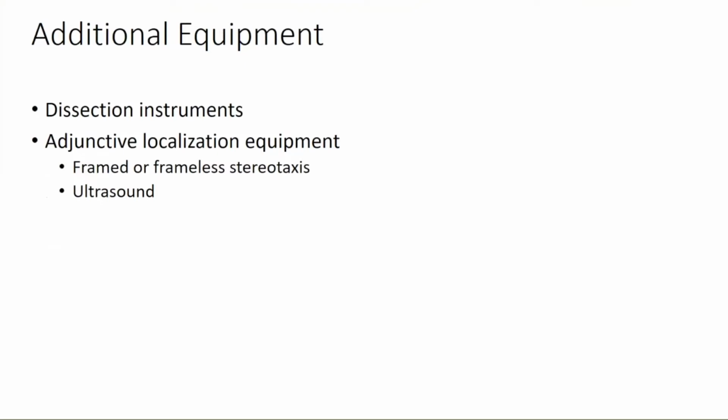We don't always need neuronavigation, but certainly since all our patients undergo a detailed scan, it literally takes a couple of additional minutes during setup to register the child and have it available, and I think it's very useful. Ultrasound we don't usually use unless the child is really young and has a big open fontanelle, but you can certainly use that too. It's actually quite helpful.